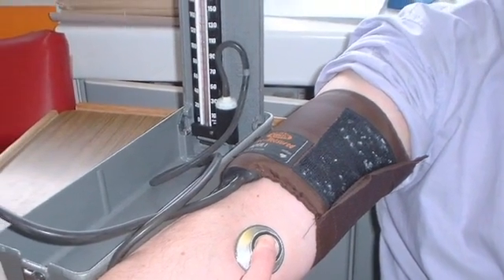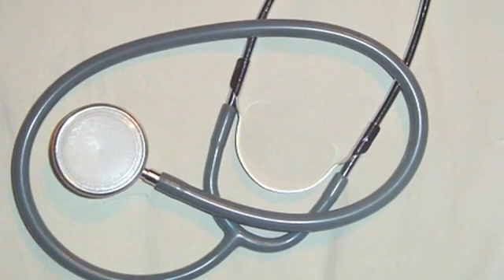Automatic blood pressure cuffs can also be used in the home. The other way that we do it, which you'd consider the old fashioned way, is a doctor, nurse, or other trained professional like an EMT uses a manual cuff with a little air bulb. It does the same thing — you pump air into the cuff around the arm, then instead of using a computer to hear the sound, you use a stethoscope. You're listening for the sound of blood flow returning to the artery in the arm that's been squeezed off by the air. This is an important method to use when the blood pressure is in doubt, or when there's some sort of abnormality or irregularity in the heartbeat or a problem with the heart that makes blood flow sometimes a little irregular. So if I'm worried about a blood pressure in a child for some reason, I'll often recheck it myself rather than just trusting the machine.